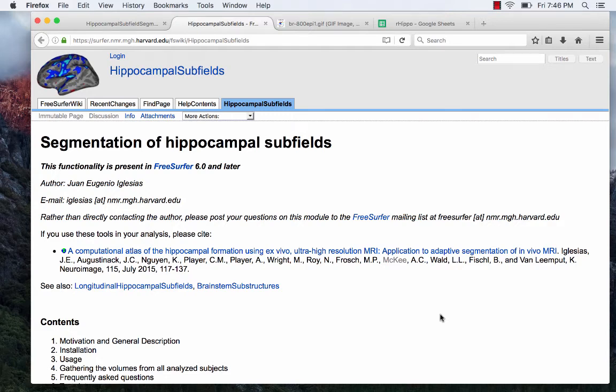Hey guys, in this video I wanted to go over how to do hippocampal subfield segmentation using FreeSurfer. I've been trying to record this video and keep rambling, so it's possible I'll cut it into two videos, but I'll try my best to avoid that.